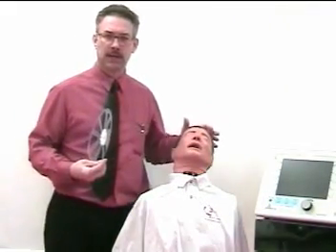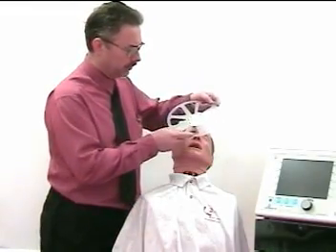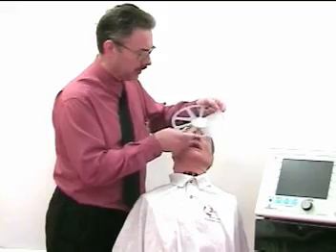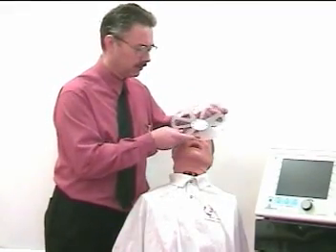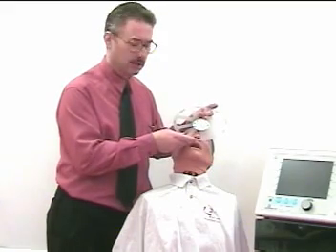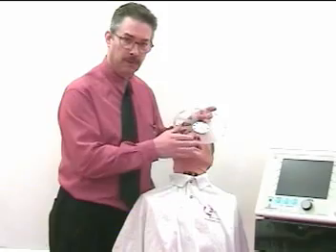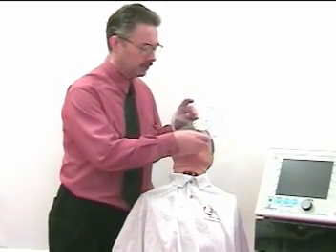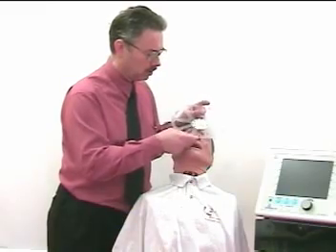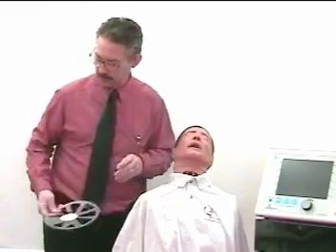You'll warn the patient ahead of time, "I'm going to be measuring your nose." Apply the sizing device onto the patient's face, and assess which is the best fit. Make sure that it's not covering their eyes or going too far down their mouth. That would cause leaks and discomfort. So in this patient, a small or possibly even a medium-small mask will work best.